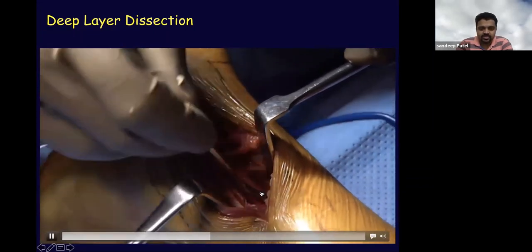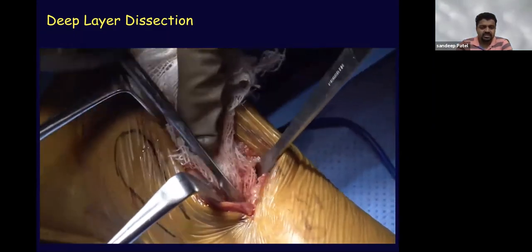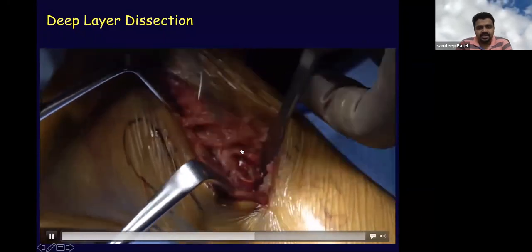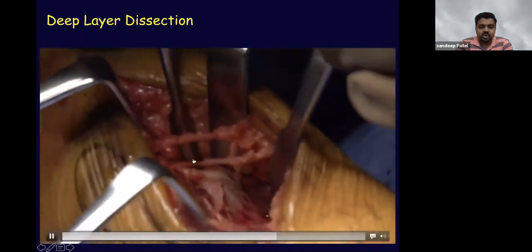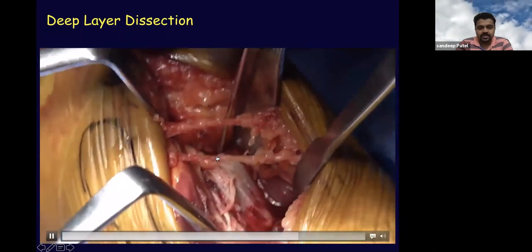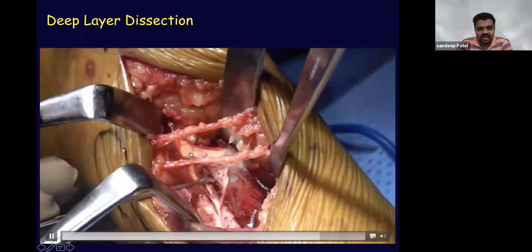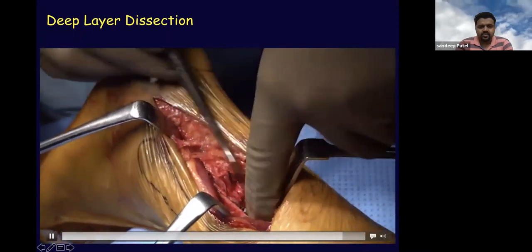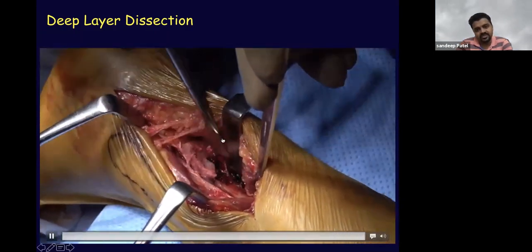Once we have adequate exposure, we put in the Homans retractor, which must be placed superiorly, as we have the posterior tibial vessels on the medial side. I'm clearing more space superiorly as required for plate application. Coming distally, we clear more space and apply the retractor. Now we can see the joint — this is the capsule posteriorly. I'm confirming with a K-wire. This whole area is the posterior malleolus. The PITFL ligament is visible here. We extended the incision because we need to plate the fibula as well — this is the complete exposure of the distal posterior surface of the tibia.